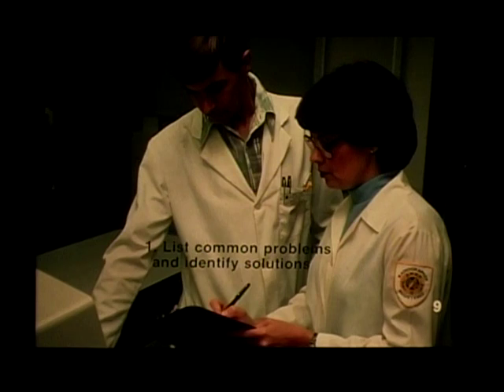Number 9. Phase 1 of a troubleshooting program involves making a list of common operational problems in the radiology department. This list is gathered from interviews with the radiographers working in the department and the professional service engineers who are called to repair the equipment. As a problem is identified, you should list several solutions for that problem. In each situation, the solution should answer the question, what do I do if?